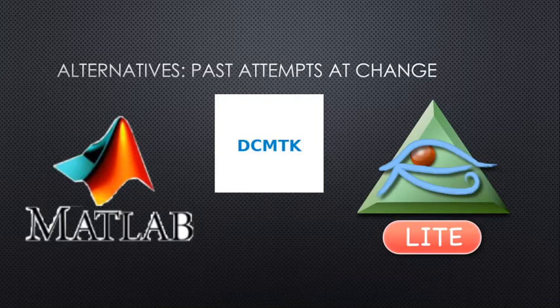DCMTK does offer some libraries for DICOM reading and handling, and it has made these MATLAB scripts possible, but they are still very limited, and they still require quite a bit of know-how just to run.